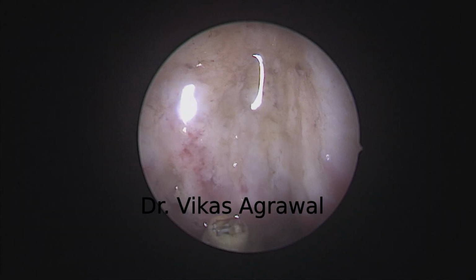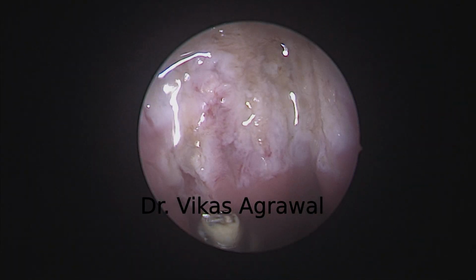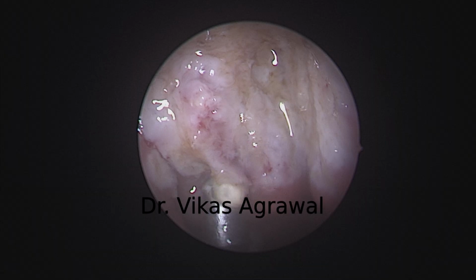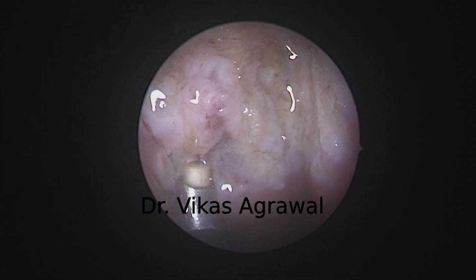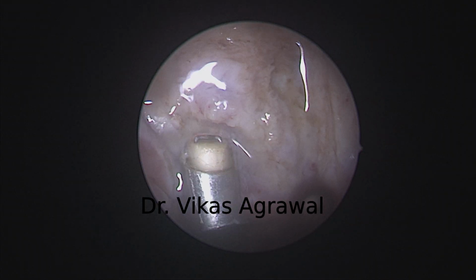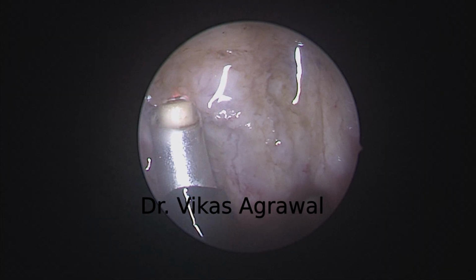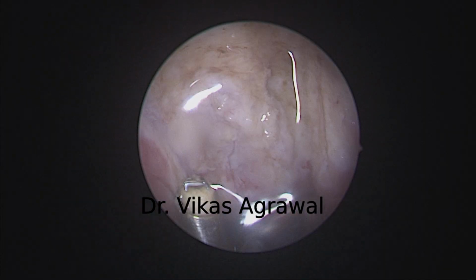That's the fossa of Rosenmuller. And as we keep going deeper, we will reach our posterior boundary, which will be the buccopharyngeal fascia. In a moment, we'll start seeing the buccopharyngeal fascia very clearly.